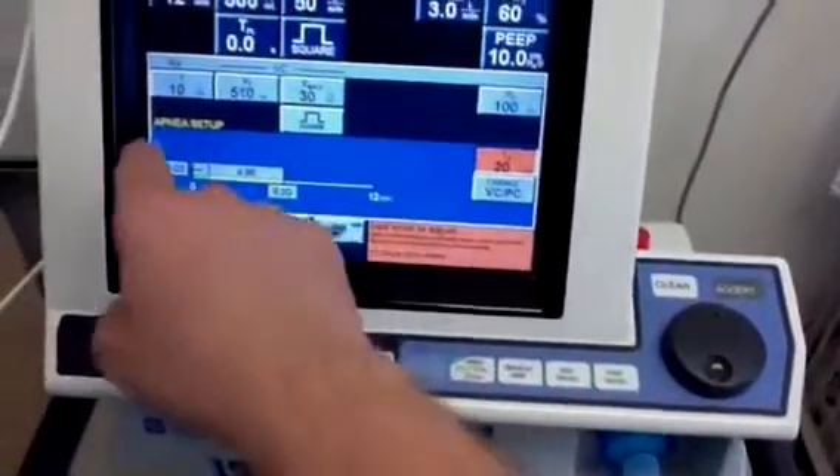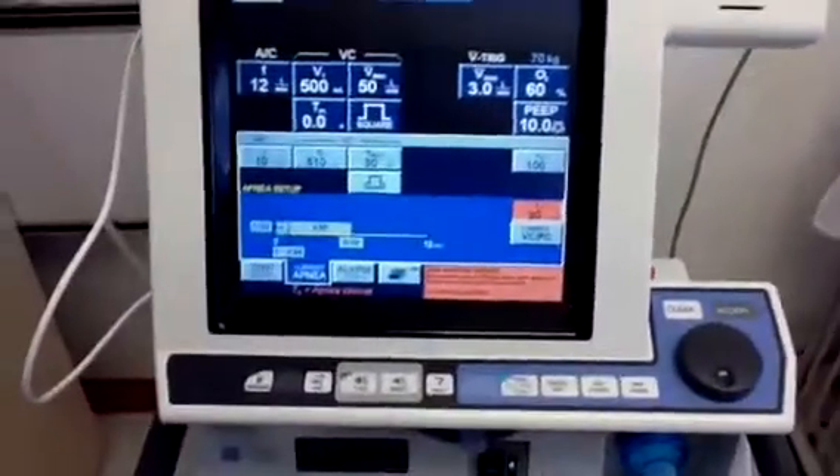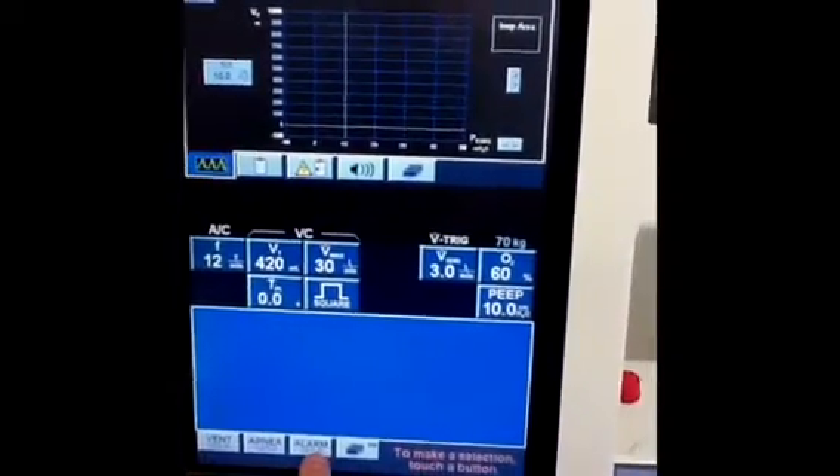Generally, the apnea interval will default to 20 seconds. There will be some preset settings — volume control, rate of 10, tidal volume of about 510 — and you can go ahead and change all those settings to whatever you want.